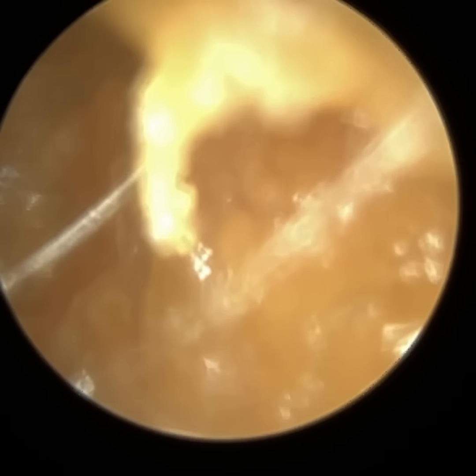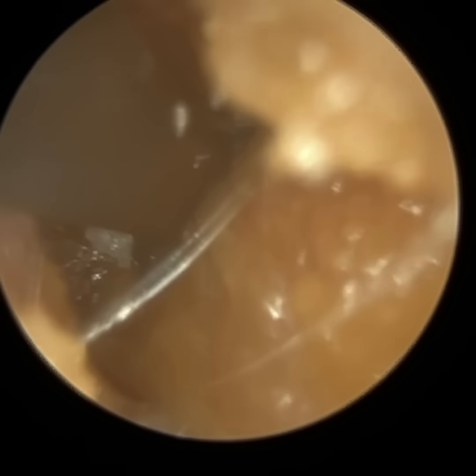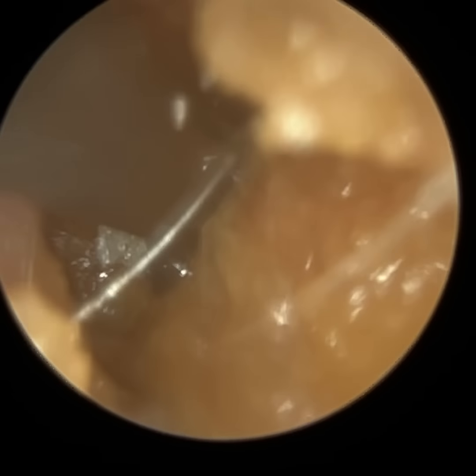You get a crease there posteriorly called the posterior malleolar fold, and to the front part of the eardrum, that's called the anterior malleolar fold. The malleolar fold separates the pars tensa from the pars flaccida — and if you go back and rewind, the posterior malleolar fold is quite prominent there. On top of the short process of the malleus — that pointy spherical portion on the hammer bone — the eardrum is sucked in, but there's no keratin accumulation. You've always got to be careful with a retraction that there's not a dead skin cyst forming, which can then turn into a cholesteatoma.